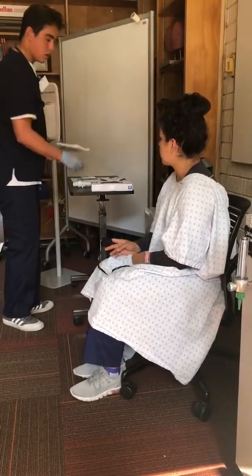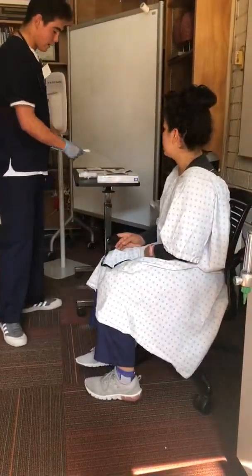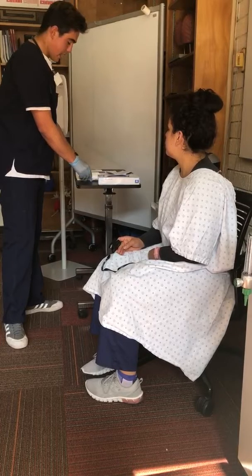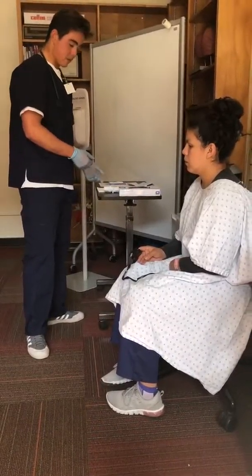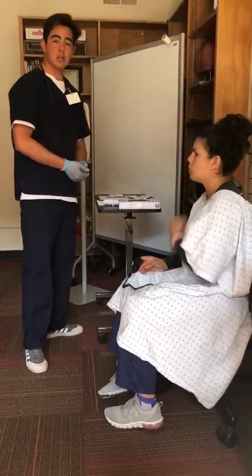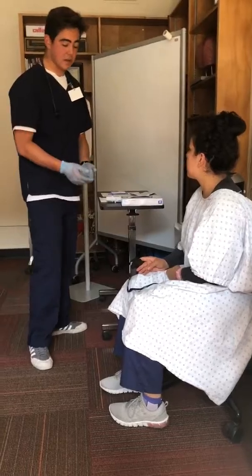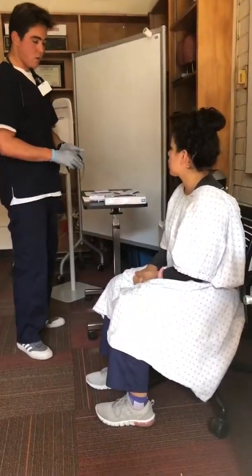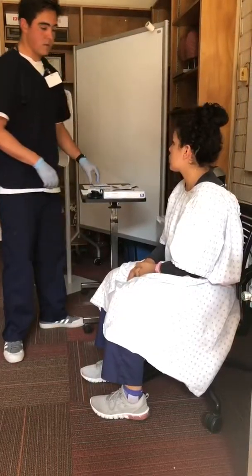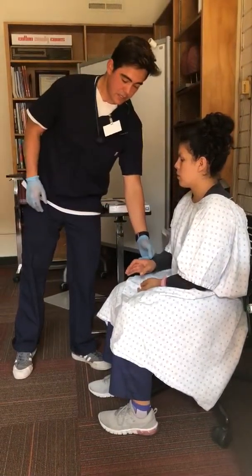Okay, may I have you cough for me into this? Okay, good cough, noting the effort of cough and any sputum production. So we want to do the color, odor, consistency, and amount. So no sputum production and a good cough, little effort to be able to generate that. So I'm gonna go ahead and take this off your finger. We're gonna note the skin signs again. So the good color, no signs of cyanosis. Good temperature to the touch.